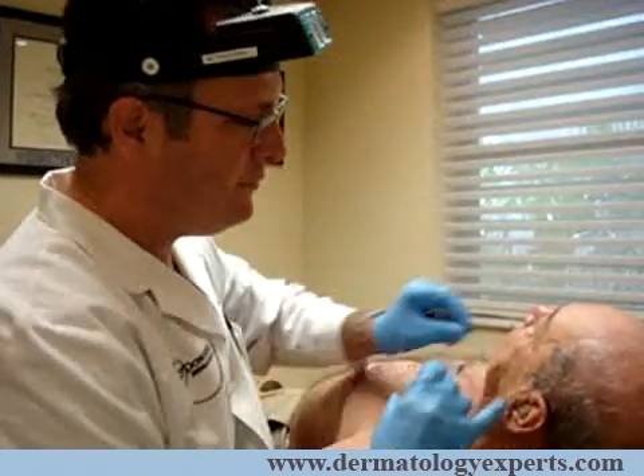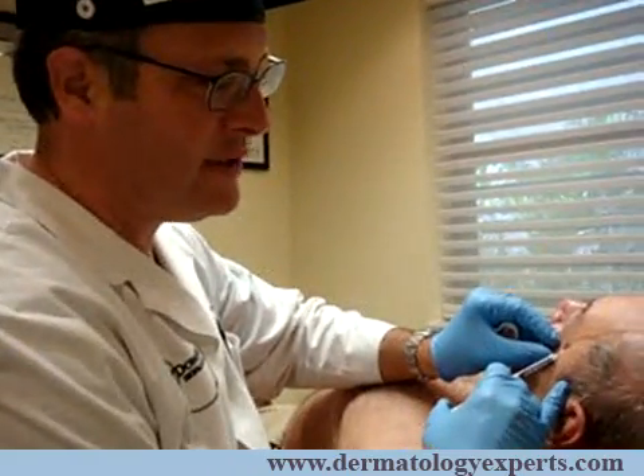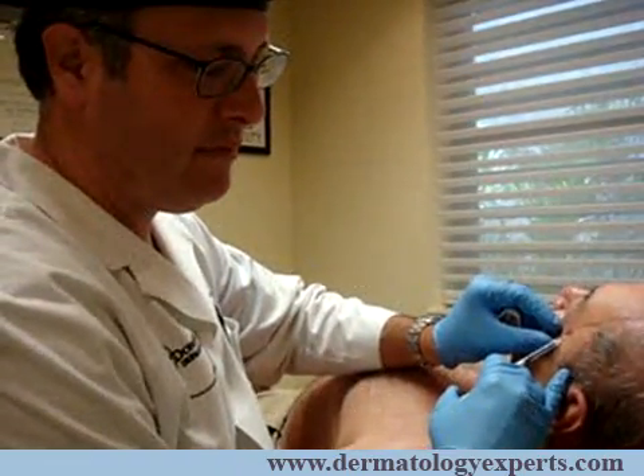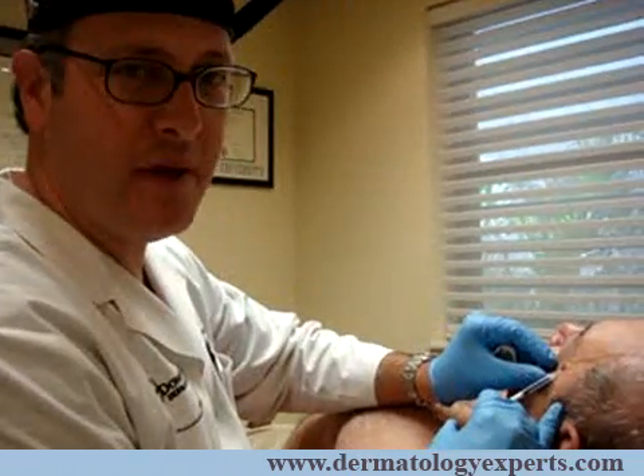I'll then take a little bit of 1% lidocaine with epinephrine, and we'll just slowly inject this into the spot. I'll tell the patient a little pinch and some burning. This anesthetic works very well — it's very quick acting. The epinephrine also constricts blood vessels, which causes less bleeding.